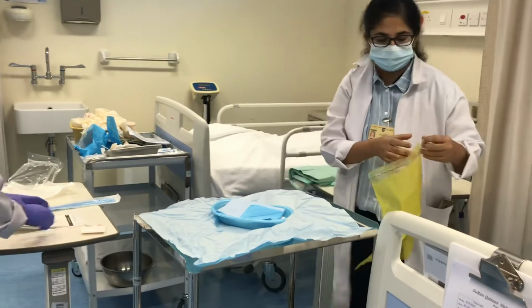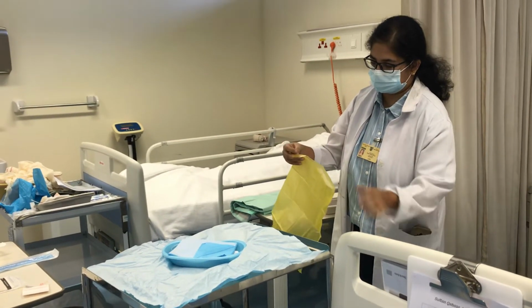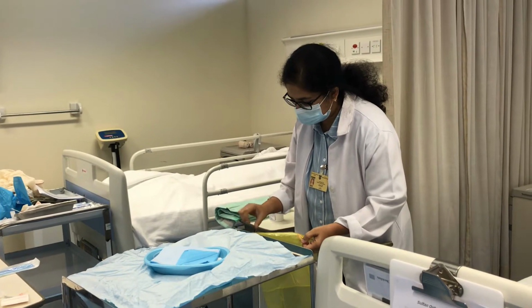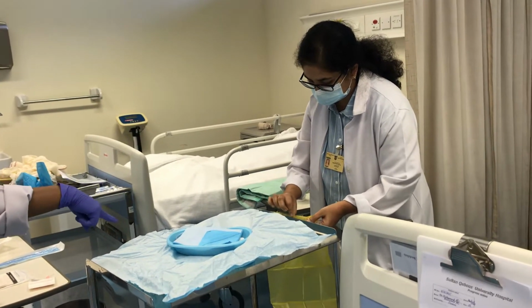Stick it with this. Because it is urine, they themselves have given the plastic inside the kidney tray.